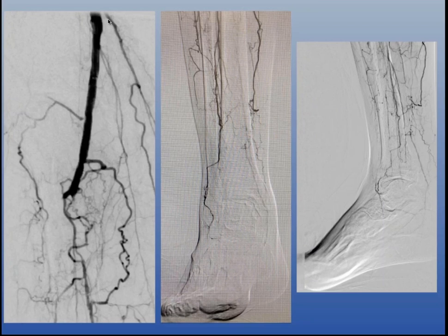So if you look at this angiogram, you can see there's basically major long segment occlusions of the anterior tibial artery, the TP trunk, the peroneal, and the posterior tibial. There may be reconstitution of the distal posterior tibial artery on the far right, just above the ankle joint on that last image.